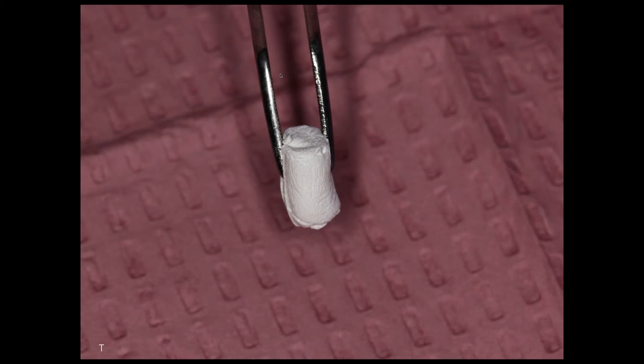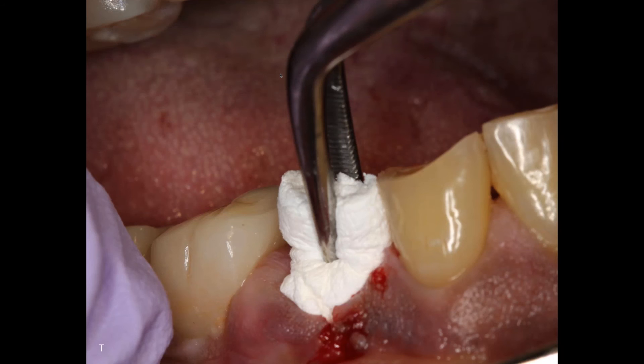Here I'm just placing it to the crestal height and I'm going to suture it. You can see I did not put a membrane. What's unique about this product is because of the composition of it and the matrix, I don't need a membrane. The epithelium will not grow into it — it will grow over the top of it. A very special product.